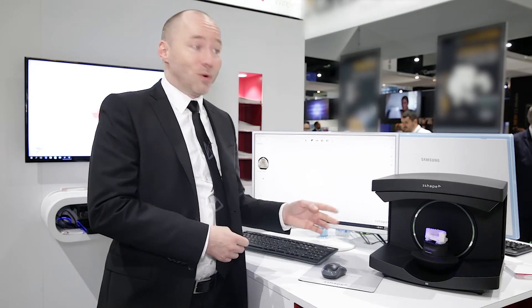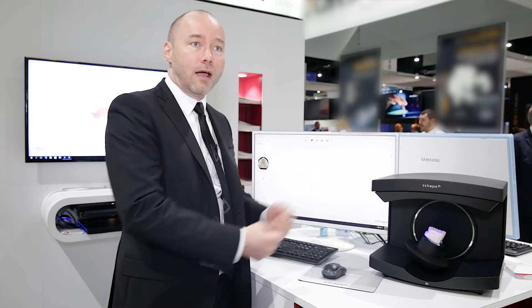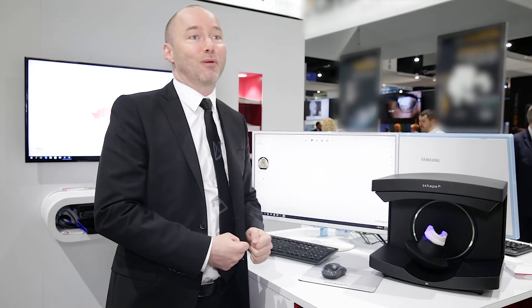This will work in ambient light, so unless you have bright sunlight pointing into it, you don't need the door and you'll be able to scan with the usual FreeShape quality in your lab at a very affordable price.